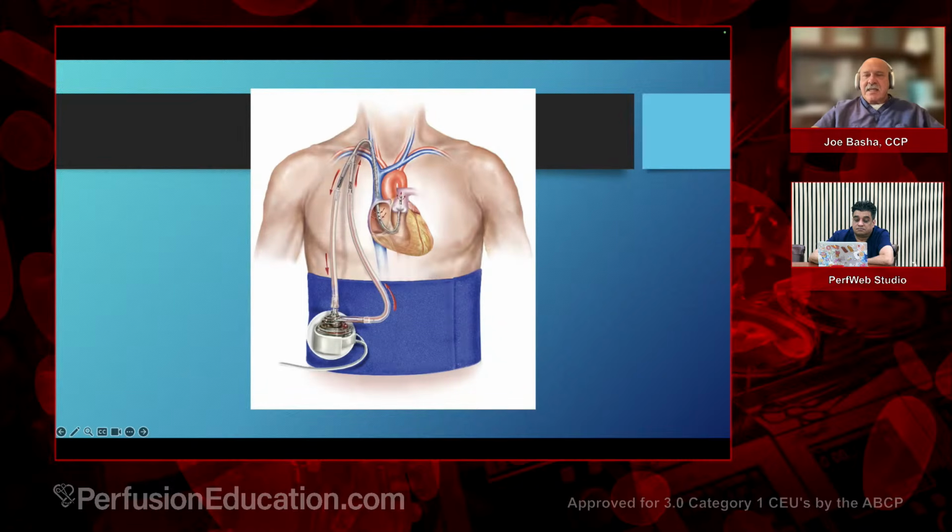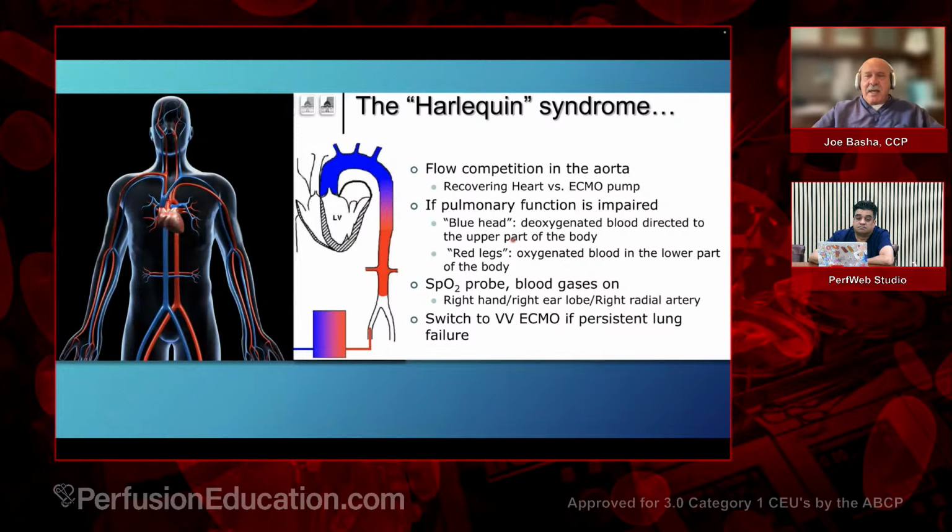And this, of course, is the Tandem Heart, and this is the Protek Duo that you see there. And Tandem really doesn't exist anymore. They sold to LivaNova, so a lot of this is somewhat dated. Keep that in mind. Here's Harlequin syndrome, a very common phenomenon.